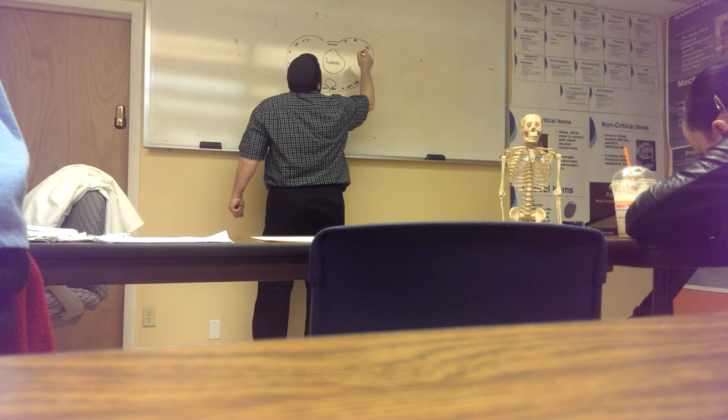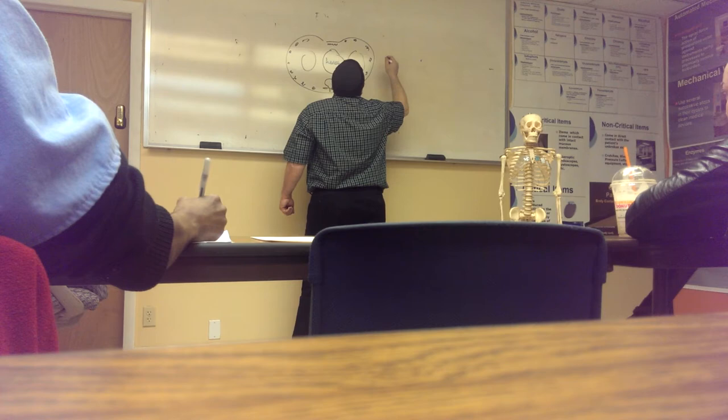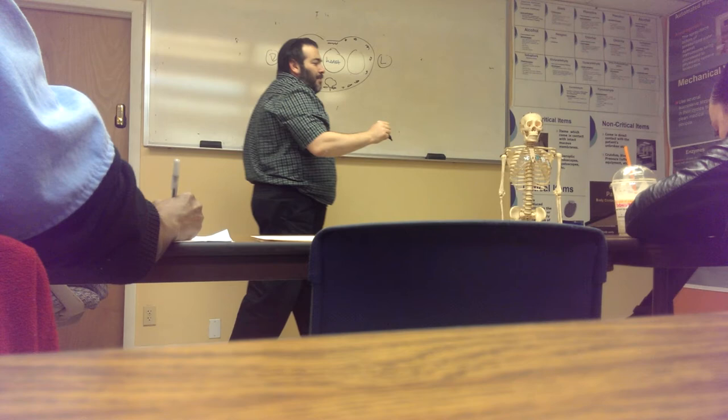These are the ribs. This is the breastbone. The lungs are over here. Okay? Now, this would be the left side. This would be the right side. Now, I'm going to show you how my stickies, how my electrodes look.